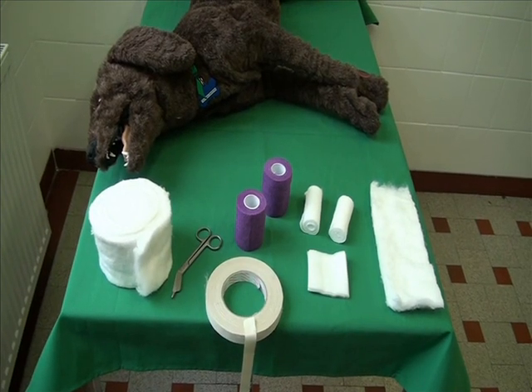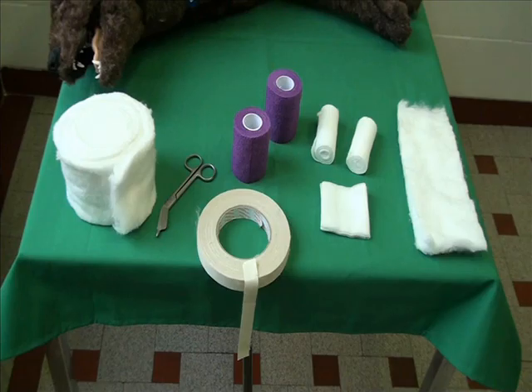A paw is shown on the model. You will need dressing scissors, swabs, cotton wool for padding, self-adhesive elastic bandages, gauze and tape. A plaster strip has already been prepared.